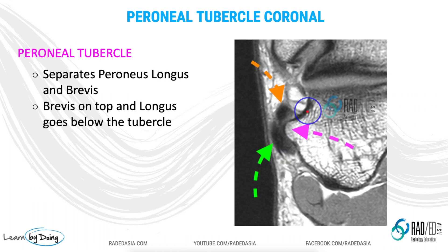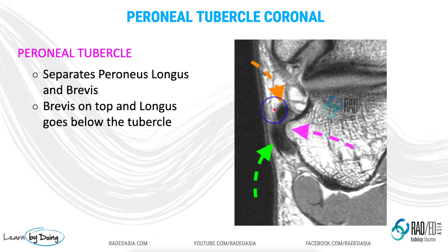On the coronal scans, we can use the perineal tubercle to differentiate between peroneus longus and brevis. They lie on either side of the perineal tubercle in the coronal images — peroneus brevis is superior to the tubercle and peroneus longus is inferior to the tubercle.